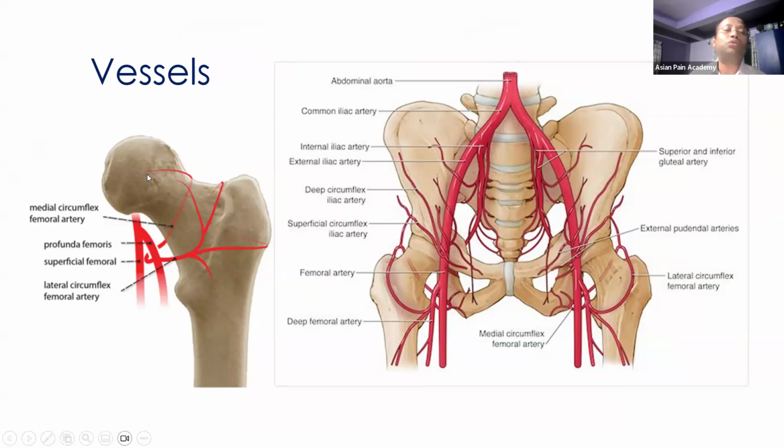If we want to do an intervention for joint effusion, remember when we go for an intervention in joint arthritis, we do not go between two bones. We inject in the recess, and fluid will go inside the joint. Here in the hip, we do not need to go between two bones. The recess area is found over the neck. Here over the neck these vessels are also there, so while doing an intervention we must take care of these vessels so that we are not puncturing them.